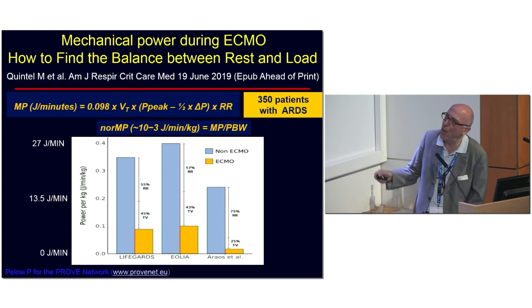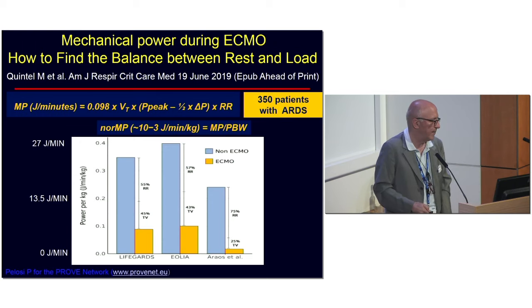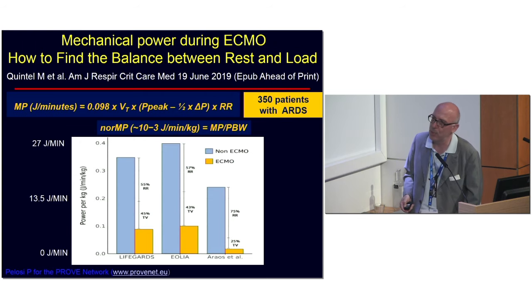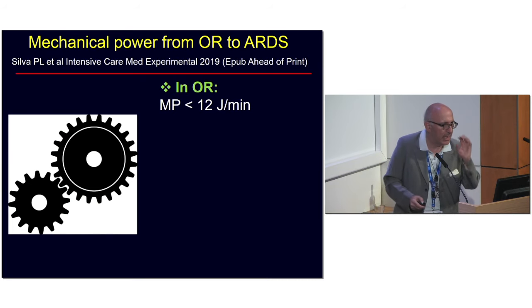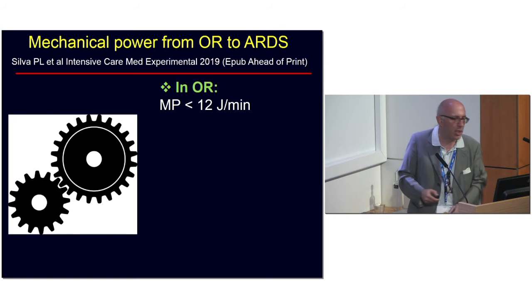So in all these studies on ECMO, mechanical power was very high, higher than 25, and there was a major reduction in mechanical power when ECMO was delivered. So, in general, I believe that we can consider this variable in the future. Of course, we need more knowledge.